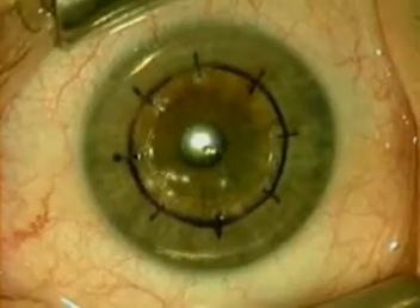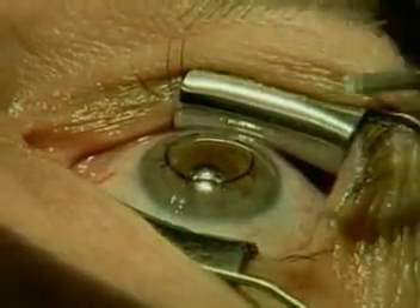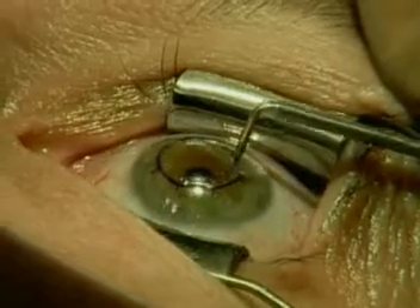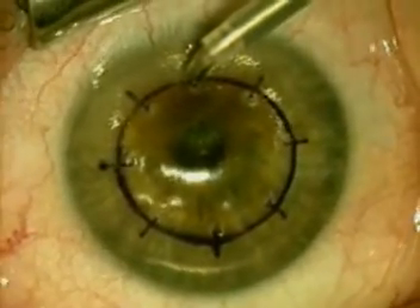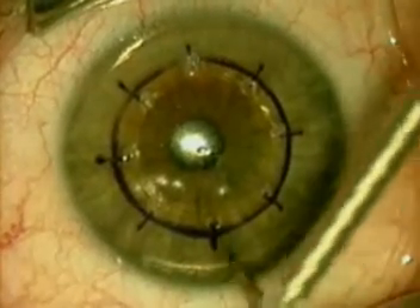You'll see the stria developing between the treatment applications in the mid-peripheral cornea, and that's what forms that belt around the zone of the cornea, steepening the central portion. This is a very well-centered treatment, and I can't emphasize enough the importance of centering the treatment on the center of the entrance pupil.